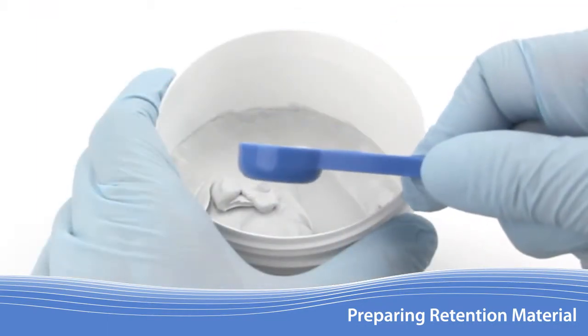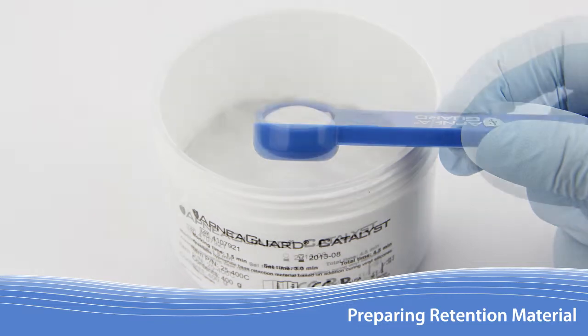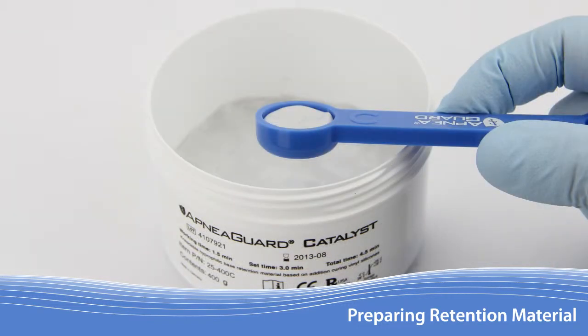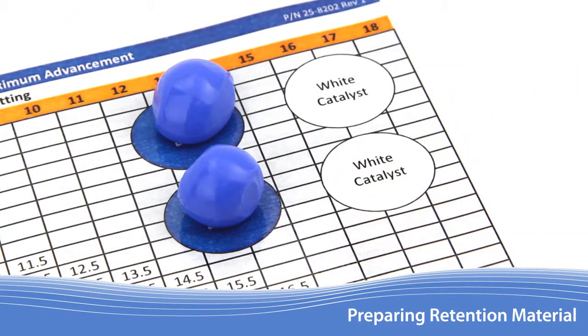Use the edge of the container to level off any excess material. Extra caution must be taken to make sure it is both completely filled and leveled flat across the top. Too much material will cause excessive drooling or reduce the space available for the tongue to advance forward. Not enough material may compromise retention of the appliance during sleep disordered breathing events. Place the material from both base containers on the work table, each in its own circle.